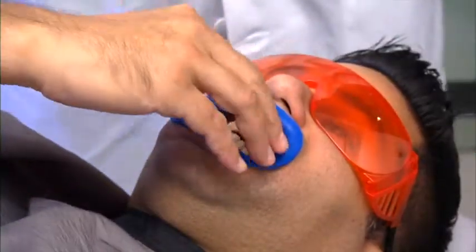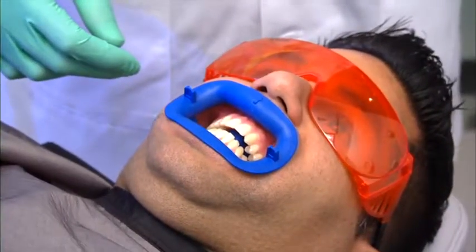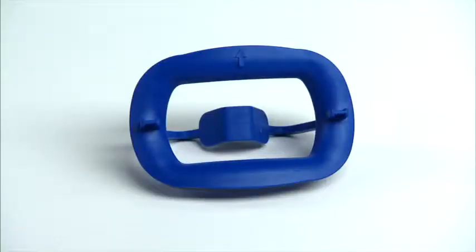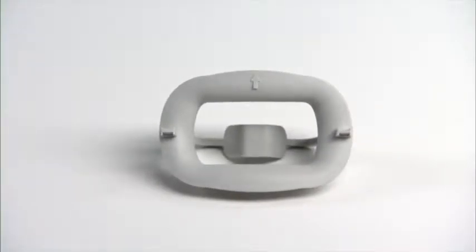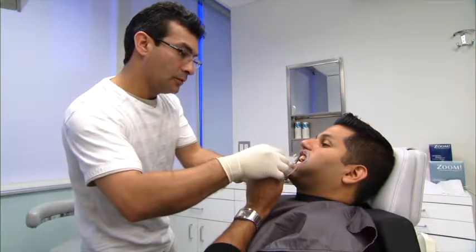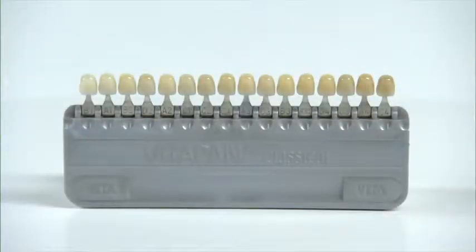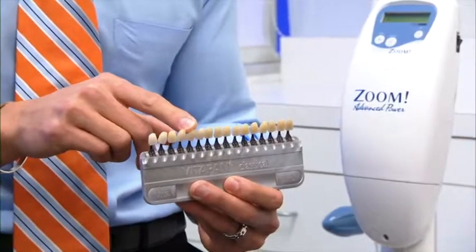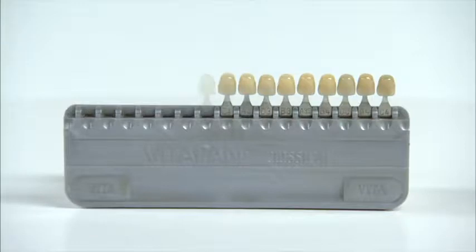Allow the patient to adjust until comfortable, and then instruct them to lightly bite down, applying continuous pressure. Again, the retractor provided is a universal size and will fit the majority of patients. Small retractors can be purchased separately. Take a retracted before photograph using a matched shade tab. To best assess a patient's whitening results, we recommend to shade match teeth with a value-ordered Vita Classical Shade Guide. Document the starting shade in the patient's chart.